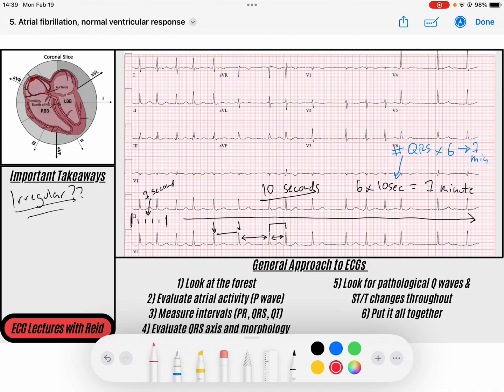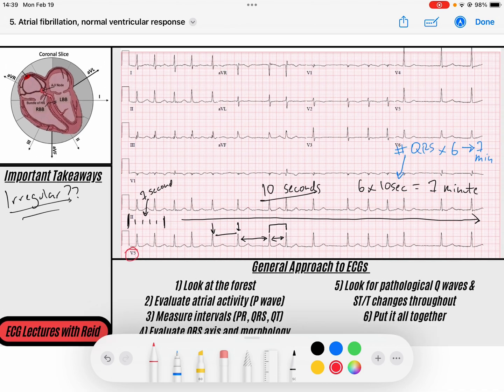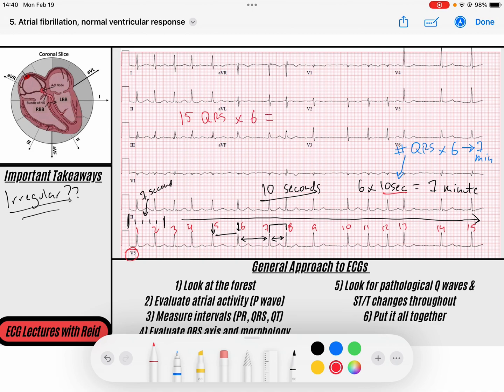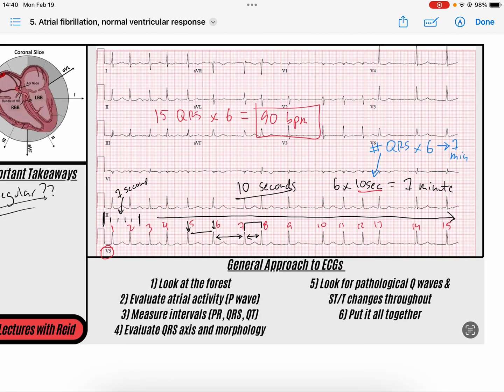Let's apply that method here using the rhythm strip. Counting the QRS complexes: 1, 2, 3, 4, 5, 6, 7, 8, 9, 10, 11, 12, 13, 14, 15. We have 15 QRS complexes in the 10-second strip. Multiply 15 by 6 and we get 90 beats per minute - that's the average rate for this person with an irregular rhythm.